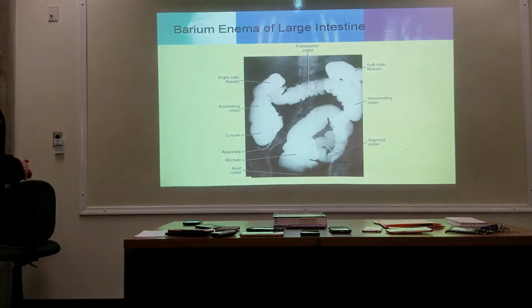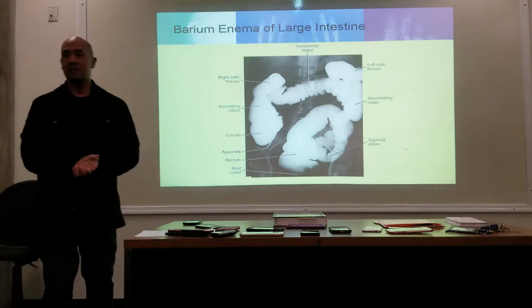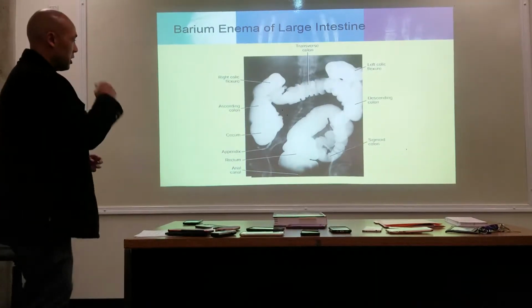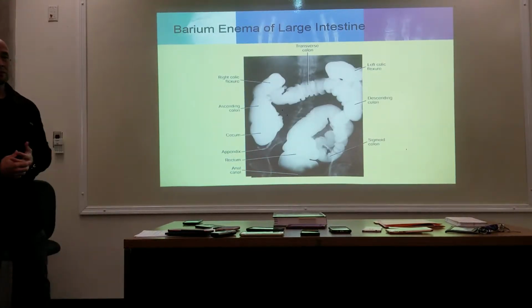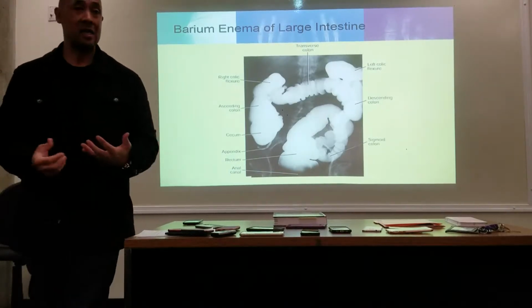So here we have a radiograph of the large intestine. What's unusual about this is that this is single contrast. Rarely do we do single contrast studies, but when we do a single contrast study, it's generally not barium. We would use iodine instead.